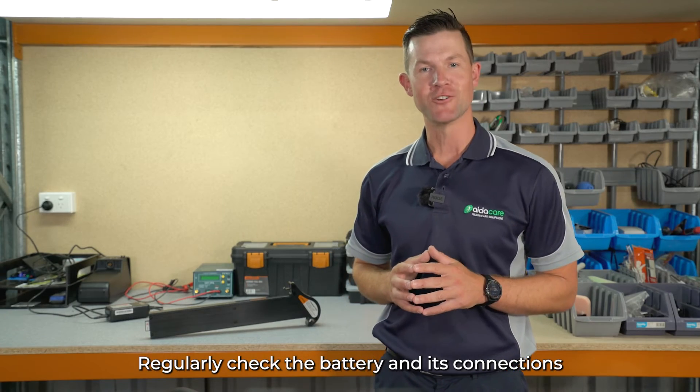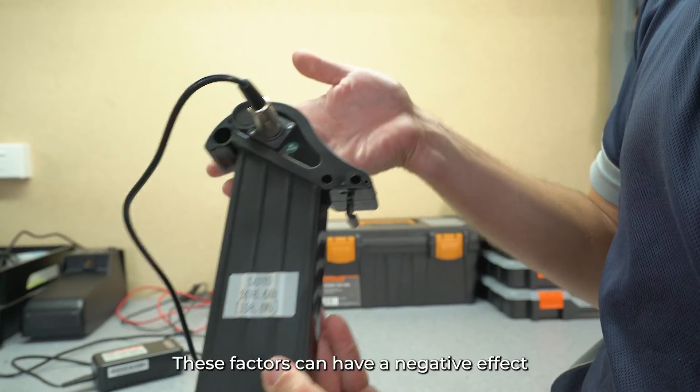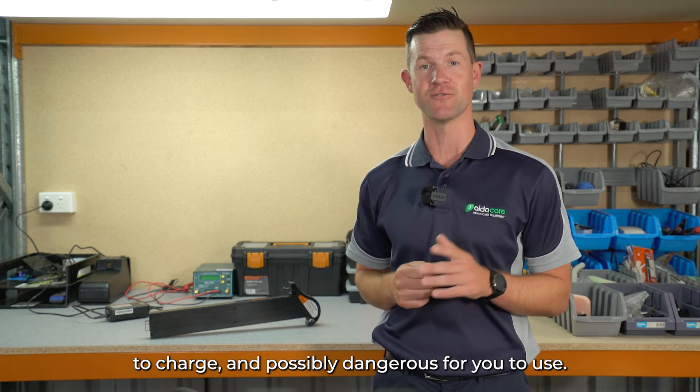Regularly check the battery and its connections for signs of damage, wear, or corrosion. These factors can have a negative effect on your battery, making it inefficient to charge and possibly dangerous for you to use.